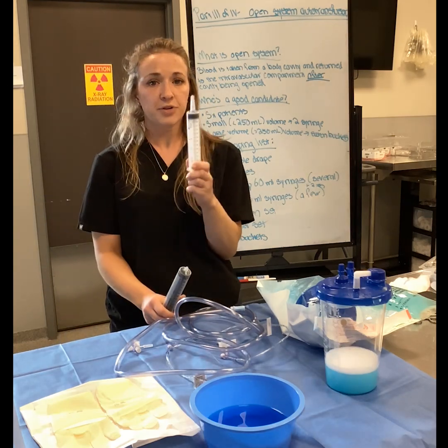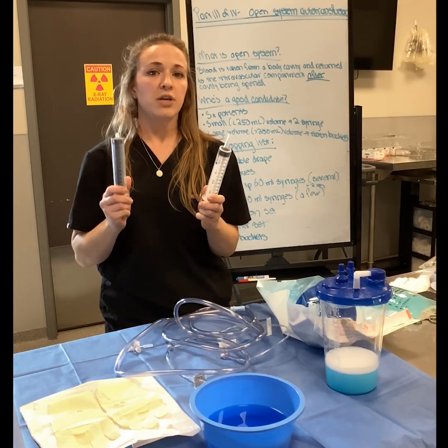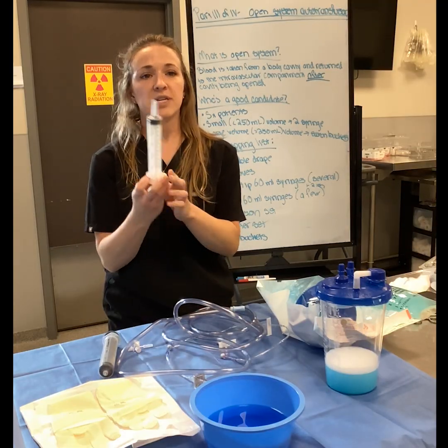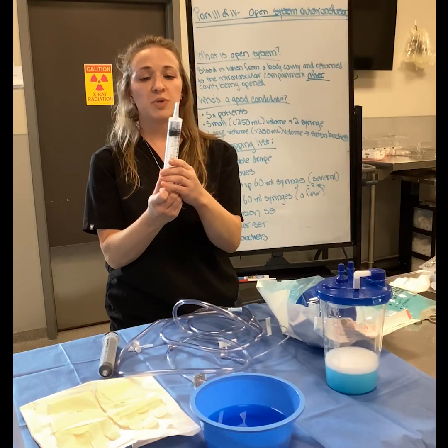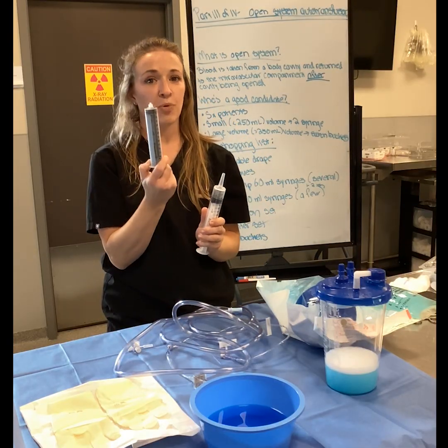For the 2-syringe technique, I like 2 types of 60 mil syringes. I like the catheter tip 60s and I like the luer lock 60s. The reason why you need both of these is because it is going to take much less time to get fluid through this very large tip here. And then you can put it in here.